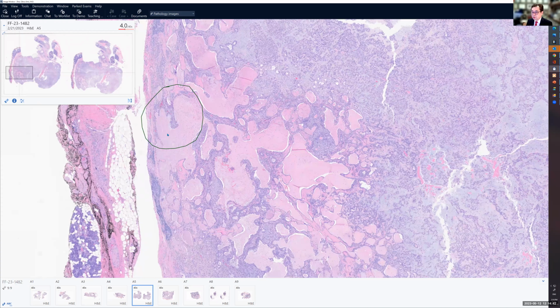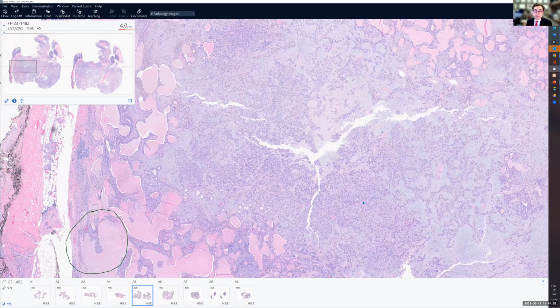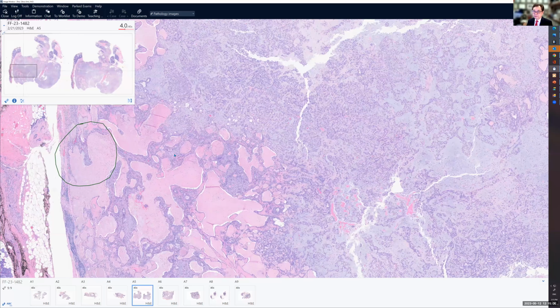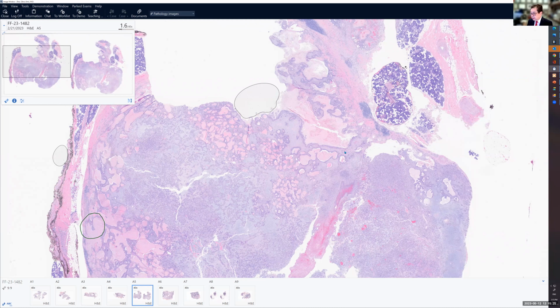But however, look at this area. This is pretty typical for what? Pleomorphic adenoma. With the fine needle aspiration history, you have to entertain the possibility that the mucocytes are part of a metaplastic process and not cancer. So in order to serve the patient who is going through the surgery, we told the surgeon, well, this is a low-grade lesion, probably pleomorphic adenoma with a metaplastic process, and we're going to do a FISH.